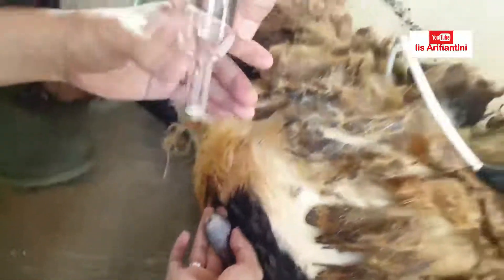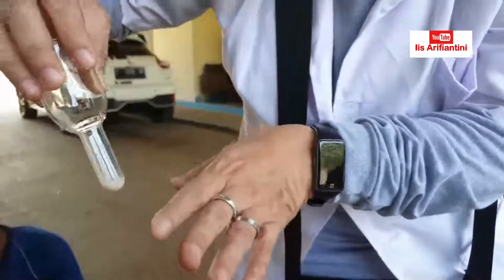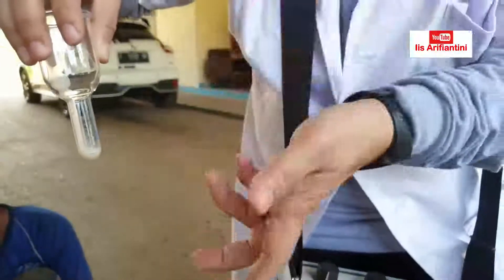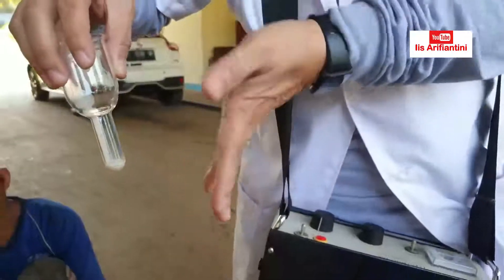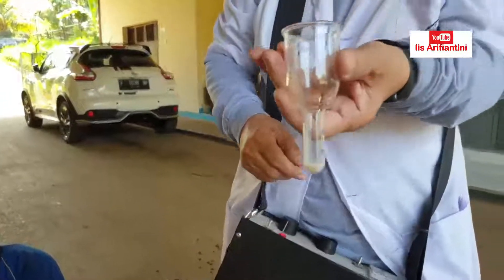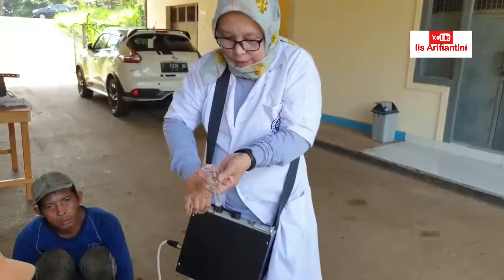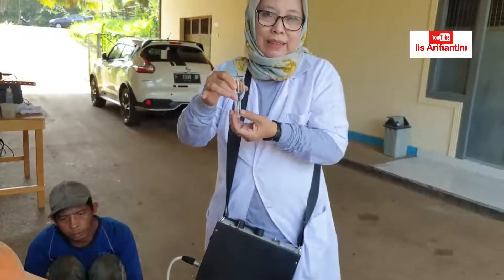Kita lihat berapa volumenya. Volume semen domba ini kira-kira 0,5 sampai 1 mili, maksimal 1,5 mili kalau ukurannya besar. Kalau cukup banyak, kita boleh melakukan kembali, tapi ganti tabung — karena takutnya yang berikutnya malah keluar urin, nanti malah tercampur semua. Ini adalah hasil penampungan dengan elektro ejakulator. Bagaimana, setelah melihat semua teknik penampungan semen: pagina buatan, kemudian massage, dan elektro ejakulator? Mudah-mudahan bermanfaat untuk kita semua. Terima kasih, Assalamualaikum Warahmatullahi Wabarakatuh.